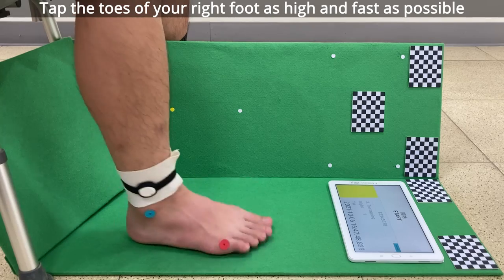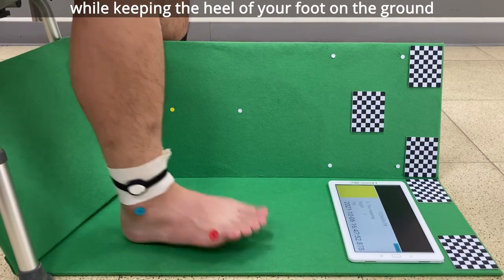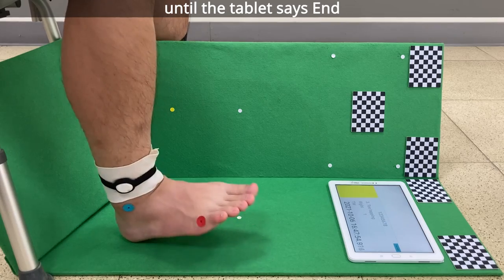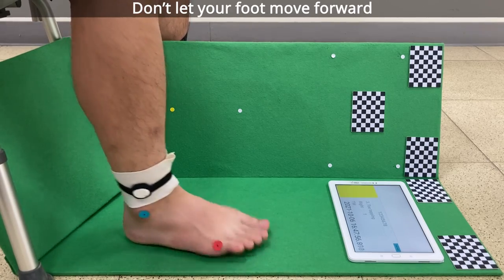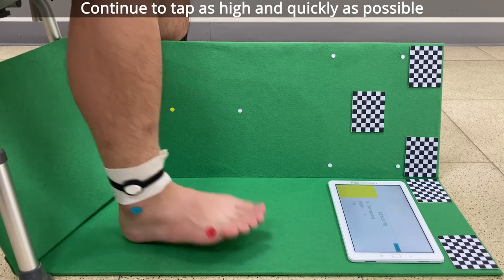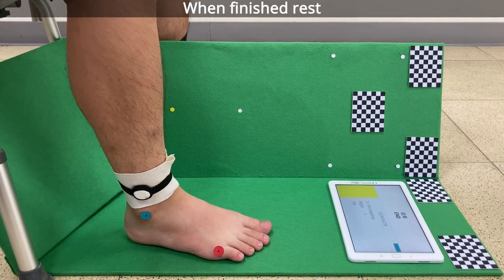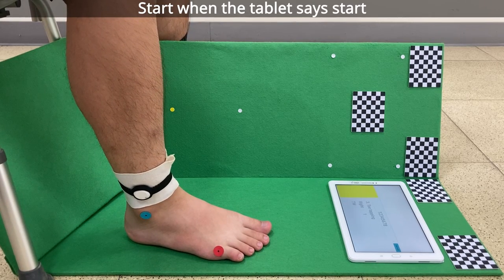Tap the toes of your right foot as high and fast as possible while keeping the heel of your foot on the ground until the tablet says end. Don't let your foot move forward. Continue to tap as high and quickly as possible. When finished, rest. Start when the tablet says start.